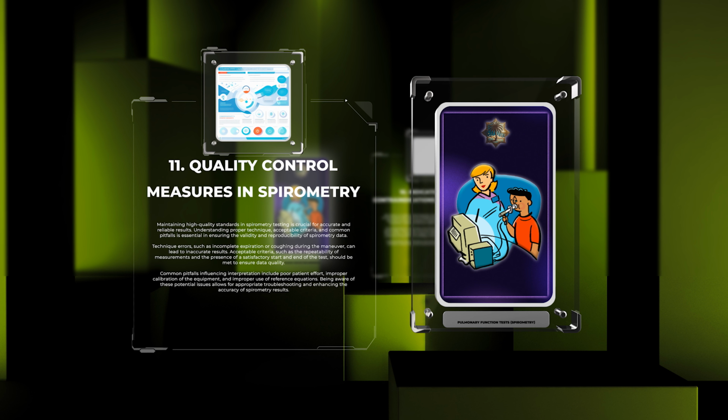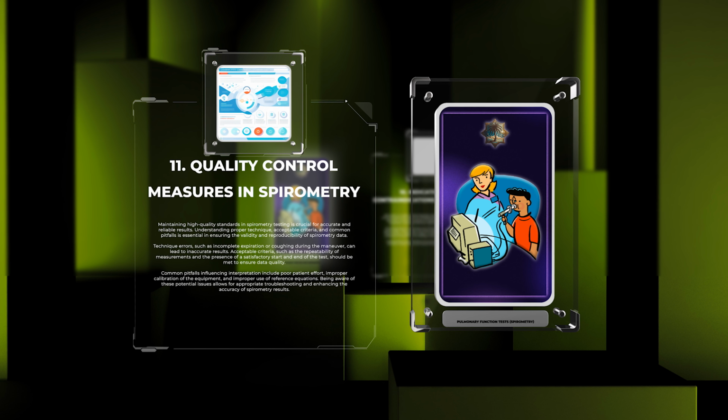Acceptable criteria, such as the repeatability of measurements and the presence of a satisfactory start and end of the test, should be met to ensure data quality. Common pitfalls influencing interpretation include poor patient effort, improper calibration of the equipment, and improper use of reference equations. Being aware of these potential issues allows for appropriate troubleshooting and enhancing the accuracy of spirometry results.